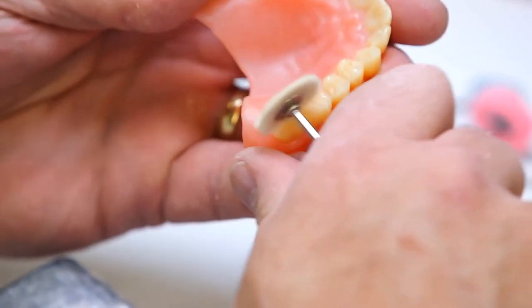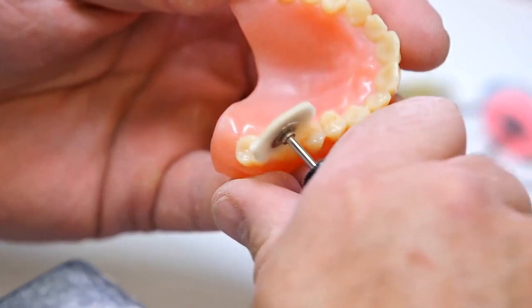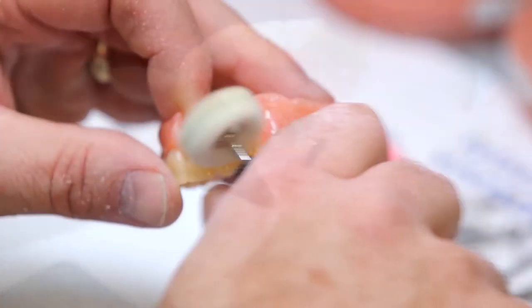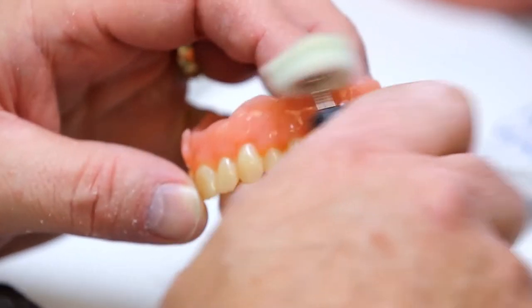Occlusal table. See how quick that polishes up. Polish the rugae that we put in there. Just going over the whole surface lightly.